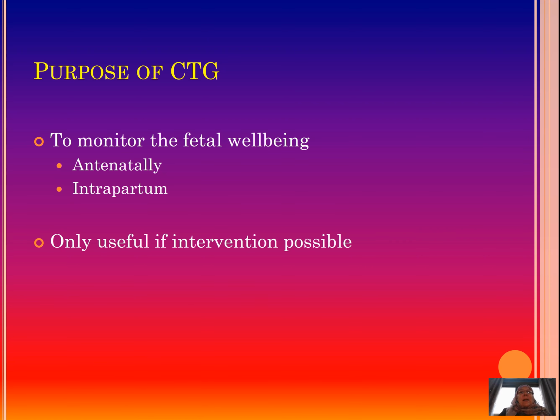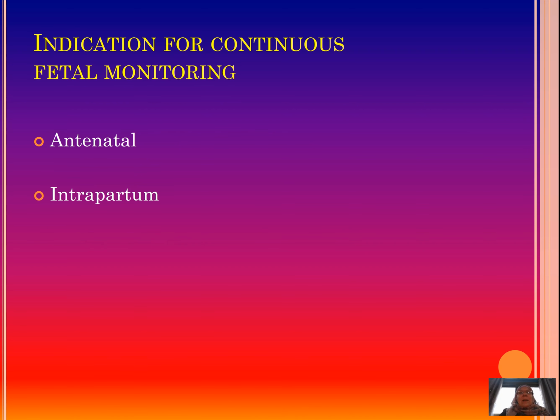So what is the purpose of a CTG? Why do we use CTGs? Essentially the purpose is to monitor fetal well-being. We distinguish between antenatal and intrapartum CTGs, and you can maybe now think a little bit about indications for continuous fetal monitoring antenatally and intrapartum.